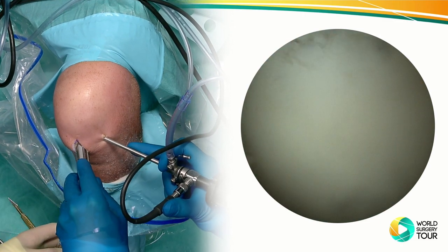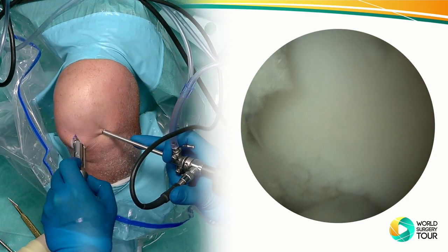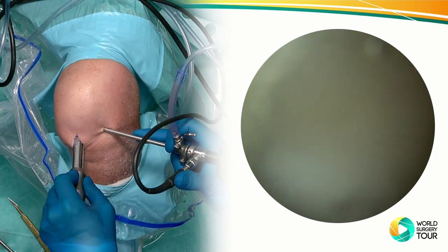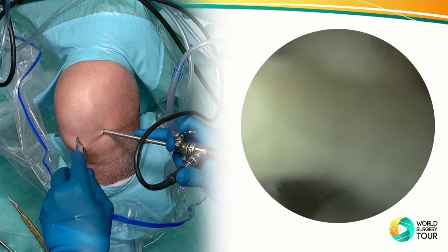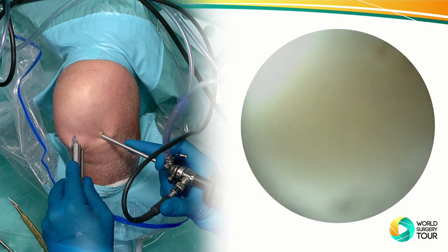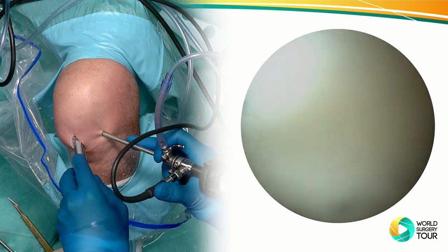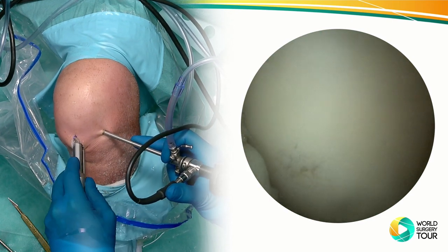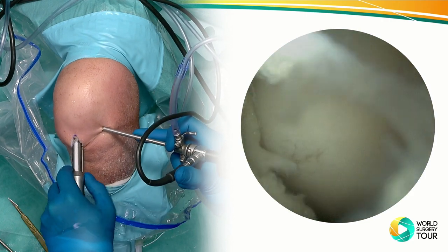By planning the surgery, are you doing some measuring? Do you know exactly how big it is? Because sometimes it looks bigger or smaller. As we said, the largest diameter of the cannula is about 10 to 12 millimeters, I believe. Correct? 10 millimeters. So you want to make sure that your defect at least can be cut.